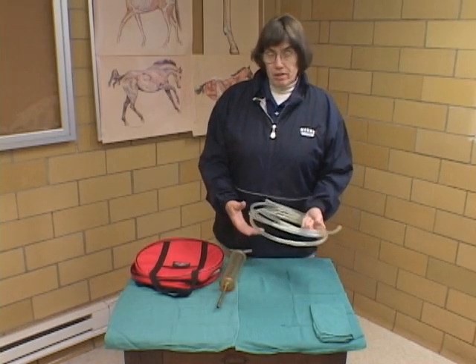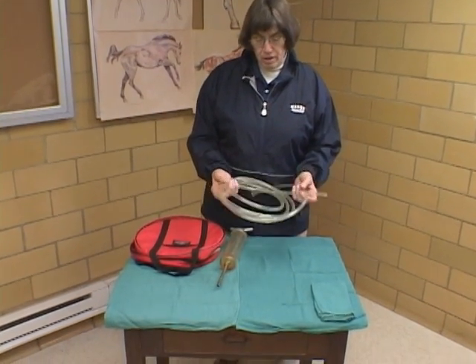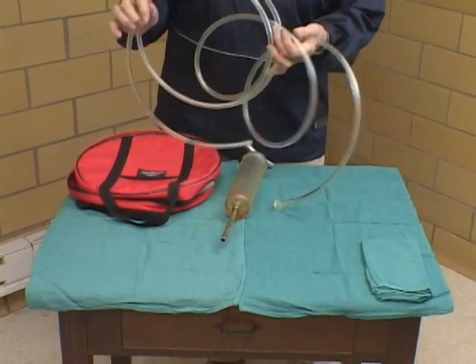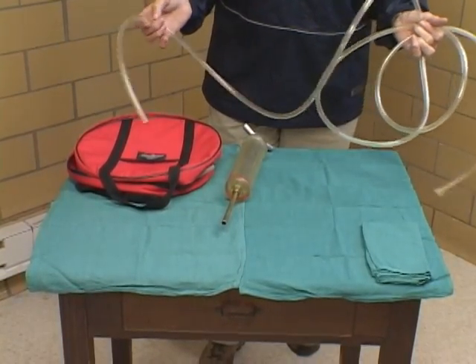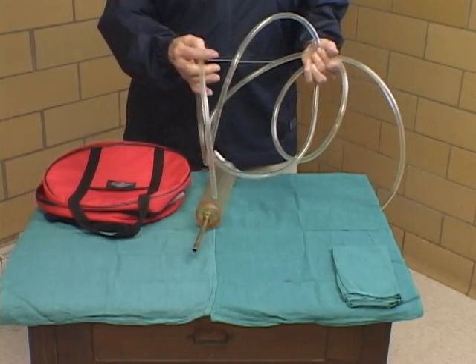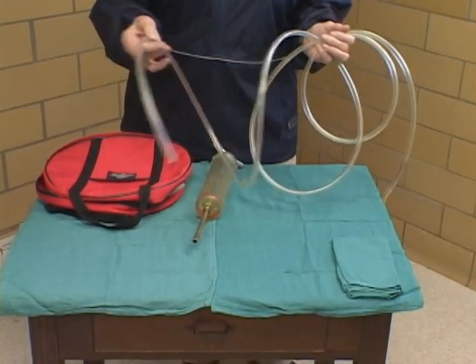I want to start by introducing you to the nasogastric tubes and talking a little bit about the care and nurturing of them. It's a long tube because it is going from the nasal orifice down to the stomach. A lot of tubes are marked in certain places, which gives us an idea of how much tube we actually have introduced in the horse.